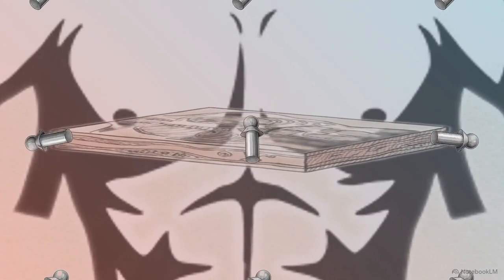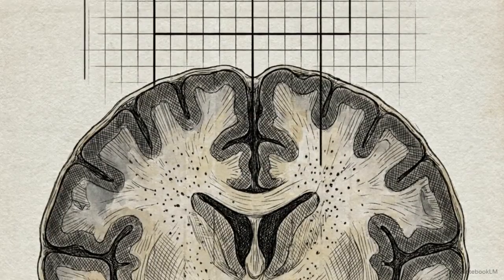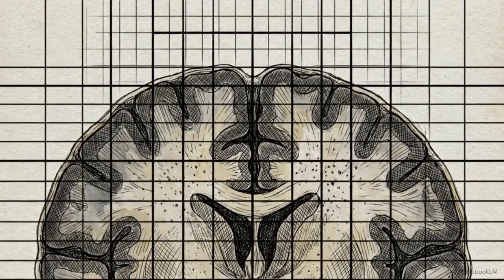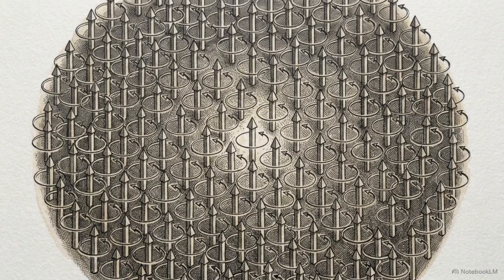Because these protons were spinning at different speeds, they begin to drift out of alignment almost immediately. Before we can measure them, the scanner briefly reverses the gradient to pull the protons back into a synchronized phase. The z-axis isolates a two-dimensional tissue plane, but millions of protons still broadcast simultaneously. We must cut it into columns. Looking at our newly isolated slice, we face a problem. Since these protons all share the same z-axis point, they precess at the exact same frequency.